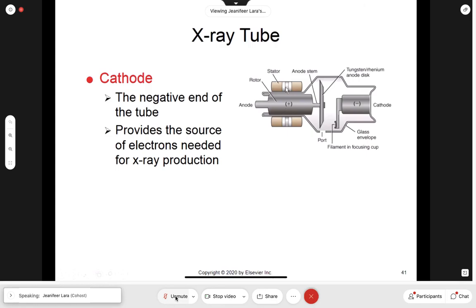The magnets inside of the stator move the iron rotor, right? This moving of the iron rotor also rotates the anode. To how fast? How fast can the anode spin? It's 3,000 in a general tube.